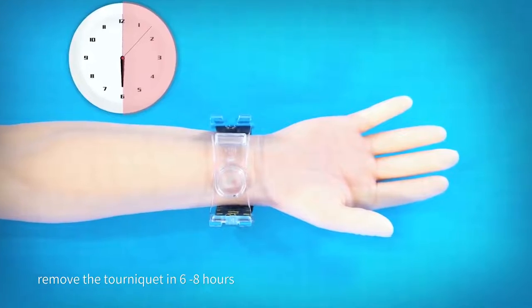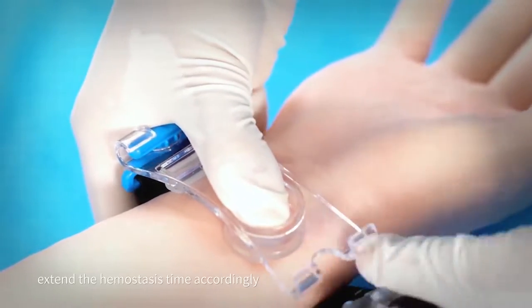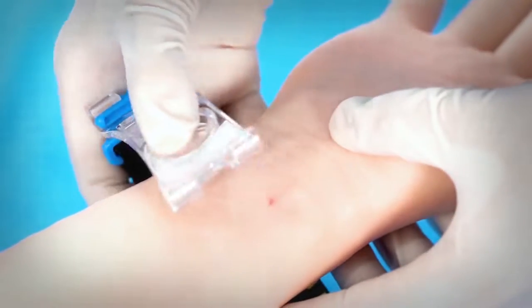Remove the tourniquet in six to eight hours. If the patient's coagulation function is poor, extend the hemostasis time accordingly.